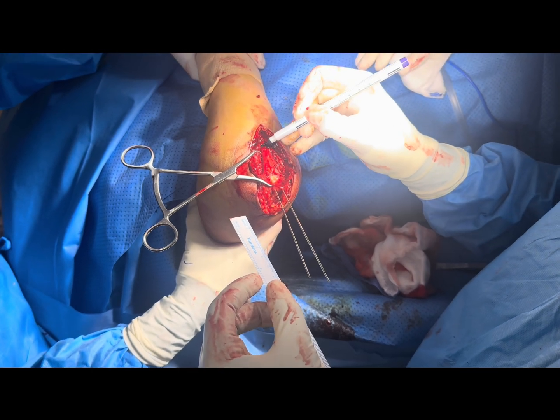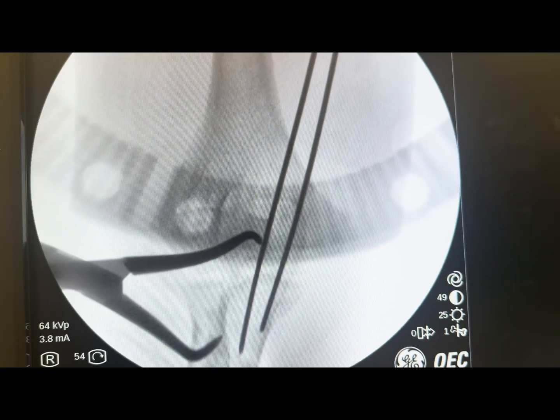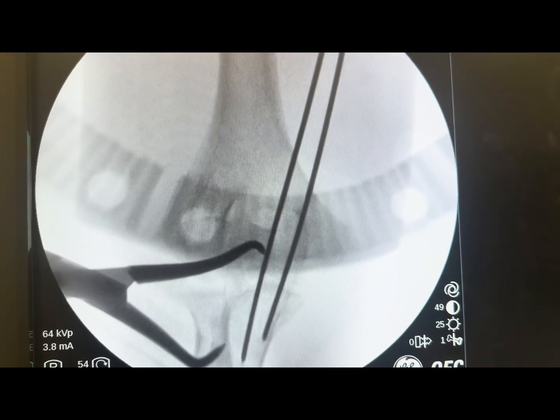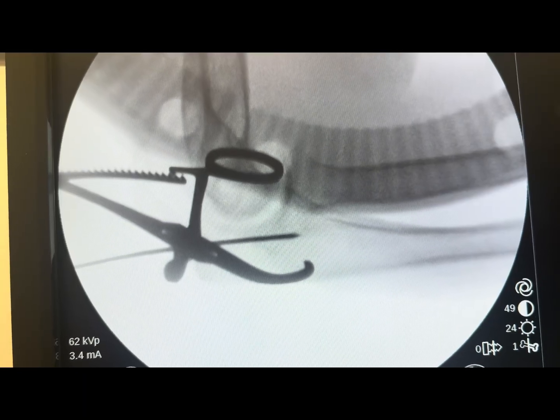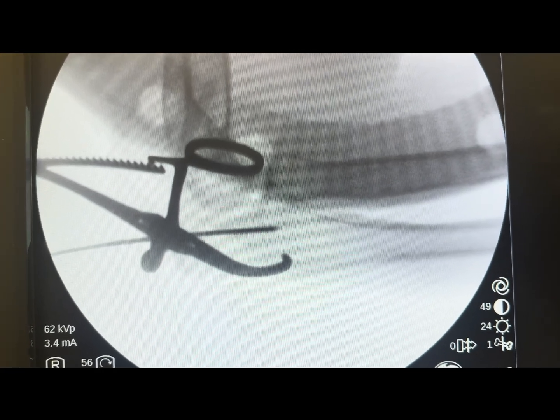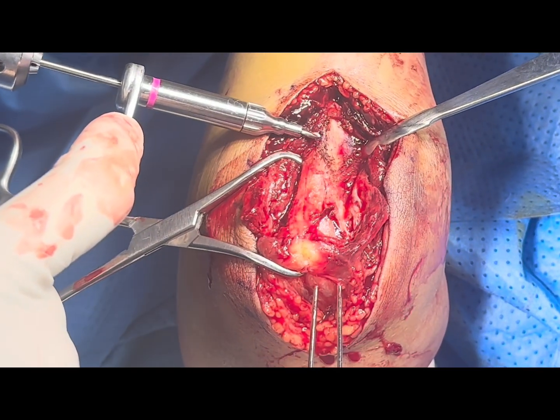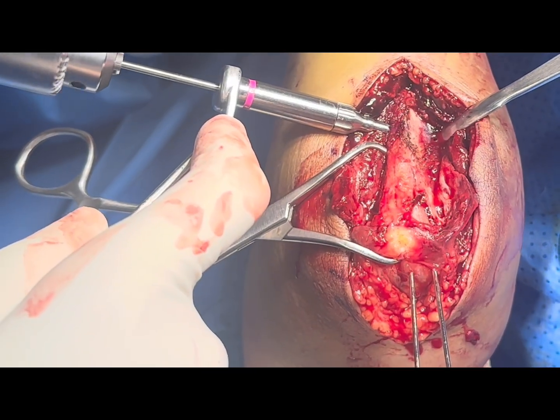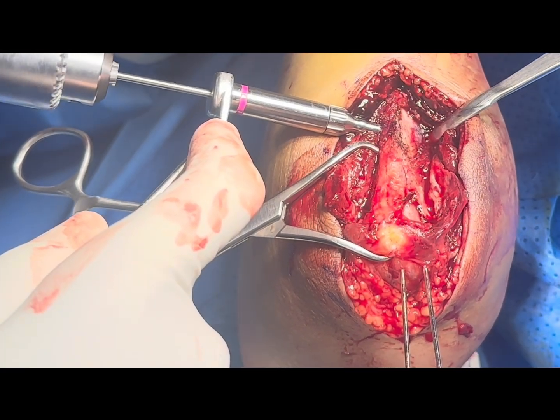We will put the encirclage wire. Give me the 2 mm drill with sleeve. This is the AP X-ray showing two parallel K-wires after insertion. You can see the wire is within the canal, parallel and holding both fracture segments. Always check in the lateral position — the wire should be pointing towards the coronoid process. As we have marked the 4 cm point, we drill 5 to 6 mm down with the 2 mm drill bit. It should not be very superficial, otherwise there is a risk of fracture.